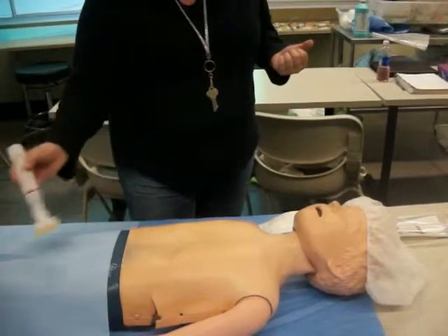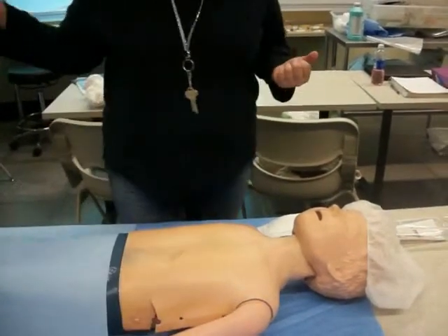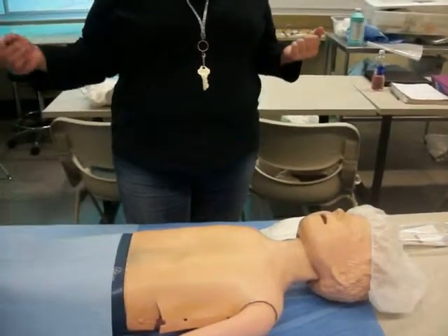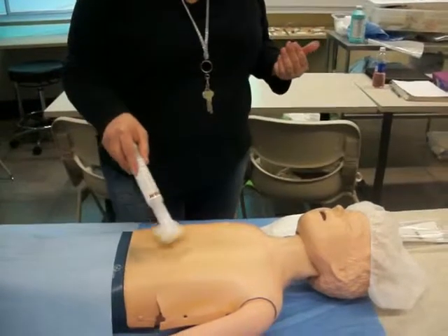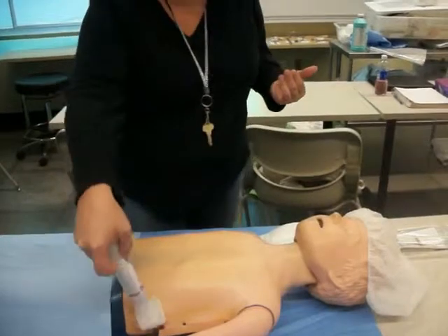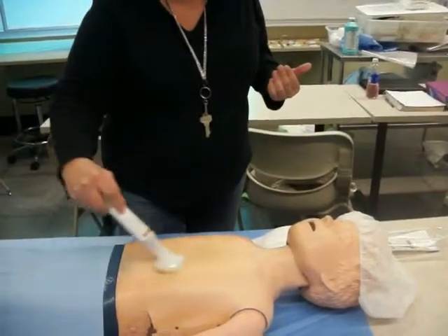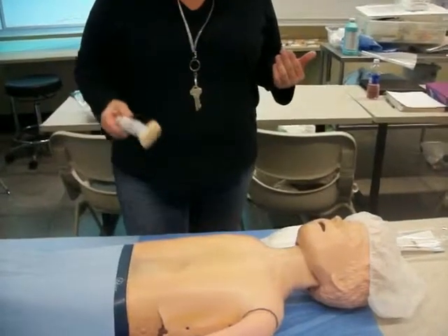Now, if you touch the linen in any way, you have to get rid of the wand and then you would have to start over. But let's say that I missed a spot — I could come back and get it at the end.